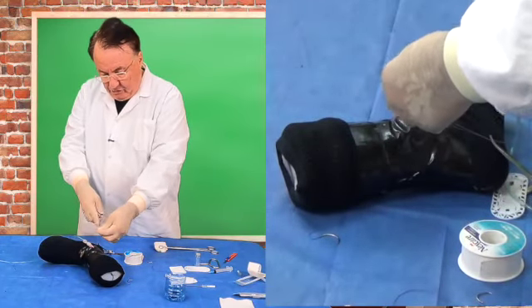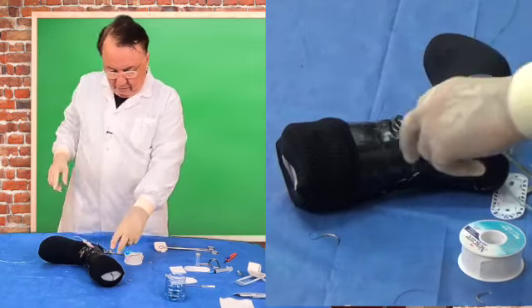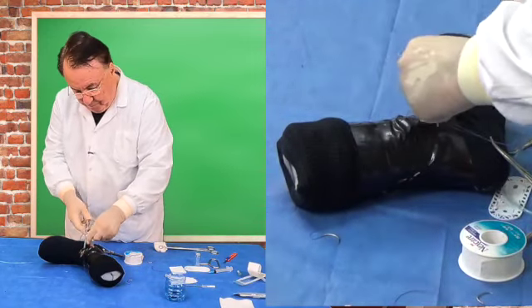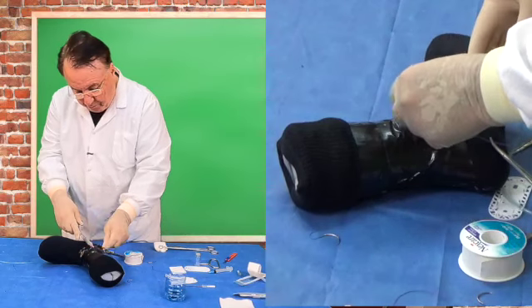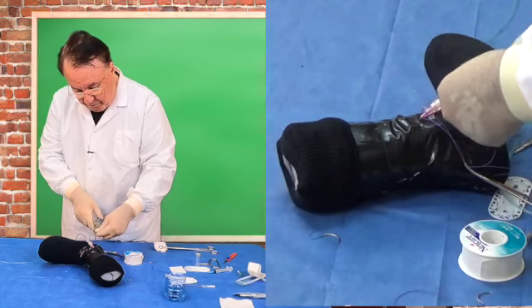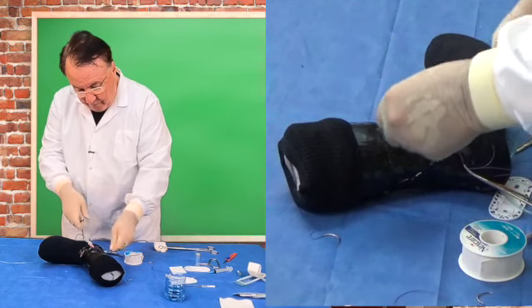I'll tie the vessel off above, but very loosely, because you don't want to crimp the vessel and have no infusion possible. So I'll just loosely tie the controlling vessel above.